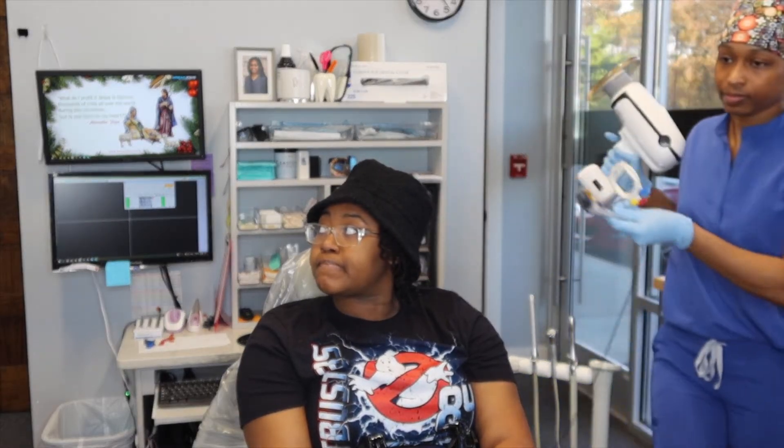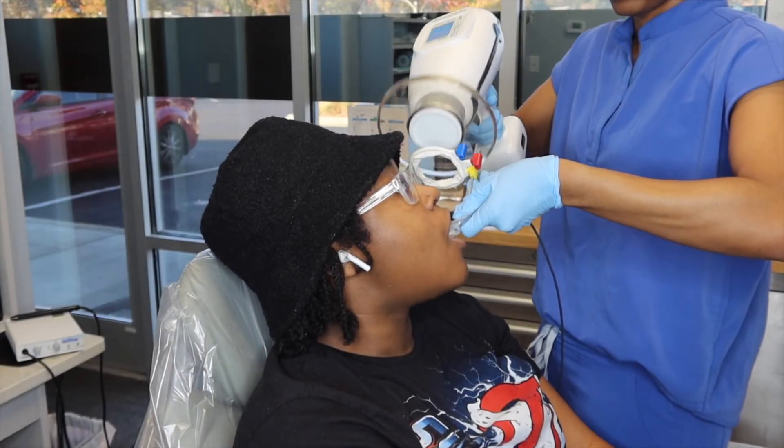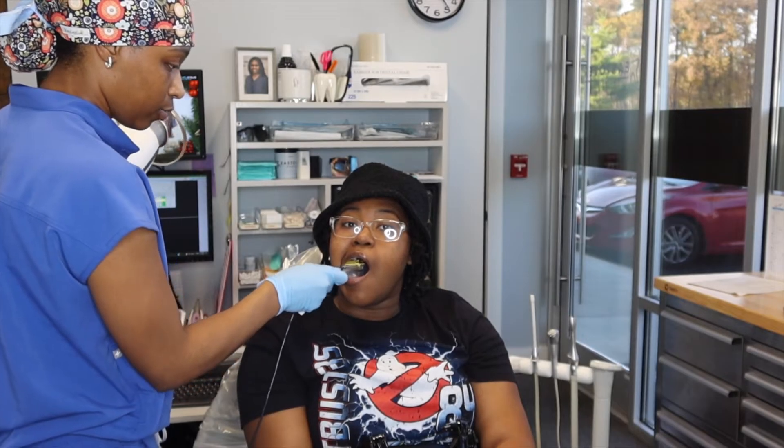I continue to stay on the left side of the patient. While setting up the ring device I make small talk to give myself a second to piece everything together, then we go right back into taking x-rays. Another tip: if your NOMAD beeps twice like mine, click it once while outside the mouth, get it positioned, and then trigger it as soon as the patient bites down — that eliminates time the sensor spends in the patient's mouth. After the upper left we go to the lower right, and you don't have to reconfigure the ring device again. All posterior x-rays are now done.